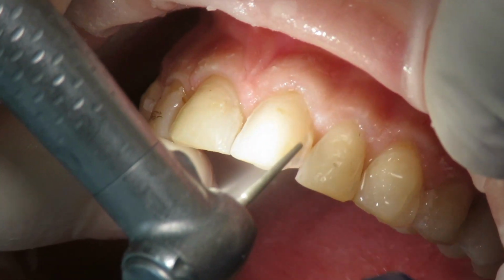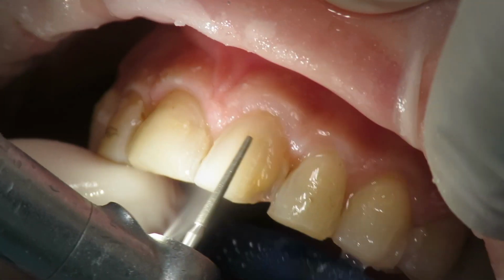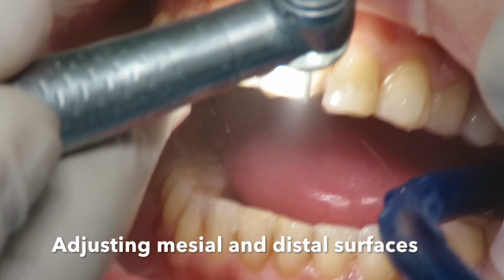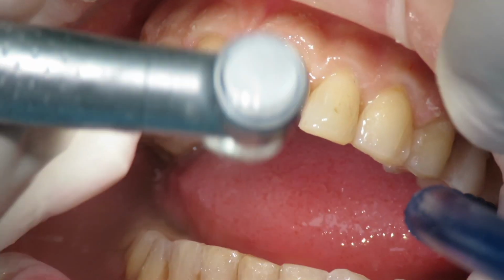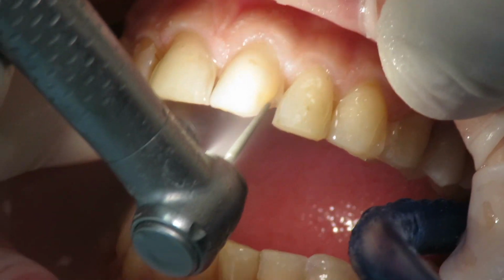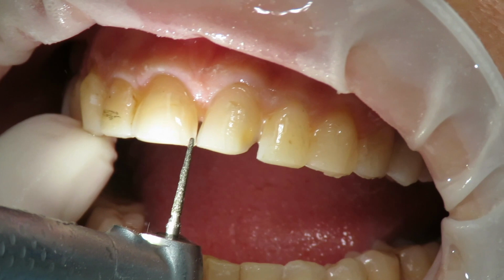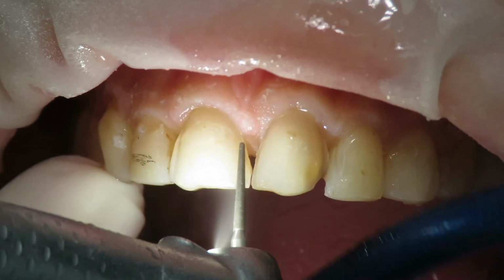Regarding the interproximal area, as you know, you have to go inside it, especially in this case on 1-1 and 2-1, where there were some non-well alignments, especially on the distal of 2-1, and there was some old composite there. So finalizing the prep, of course, moving to a thinner burr just to finalize the level of the margin.